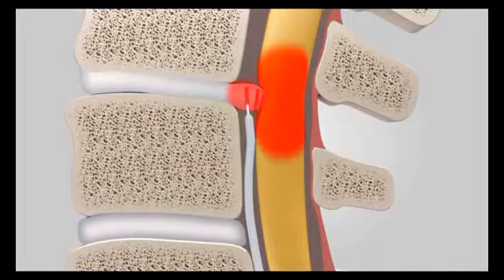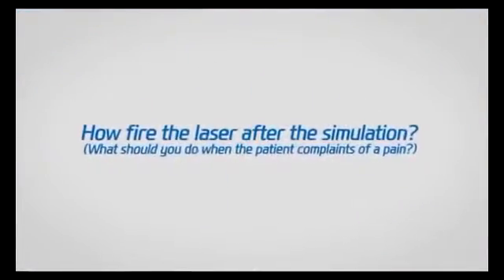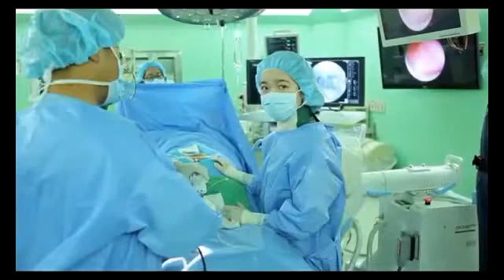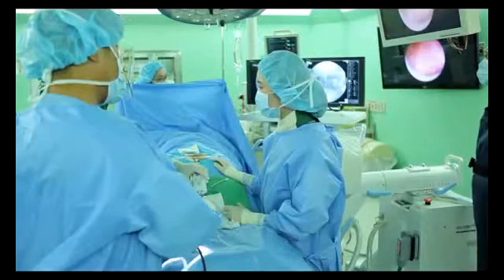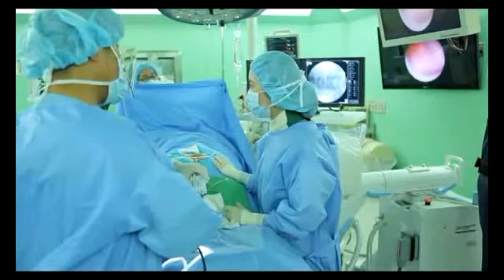When stimulating, if the patient appeals the pain on the leg, it means there is a nerve root. Never shoot that point. If the patient appeals the pain on the disc or doesn't feel the pain in spite of stimulating, it means there is not a root, so you can go shooting. Stimulating is a technique for safety for patient and surgeon. You can understand where the right place to fire the laser is by stimulating. Now, it's real laser treatment.